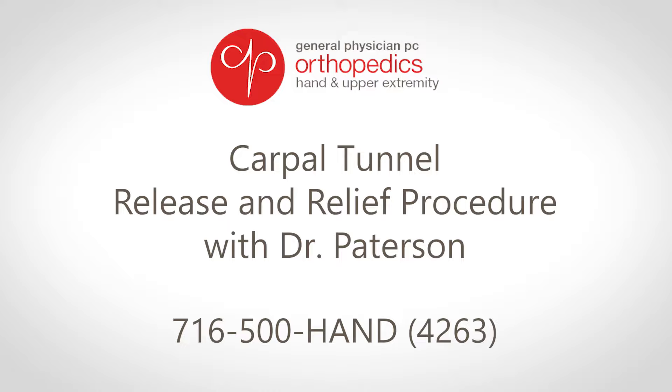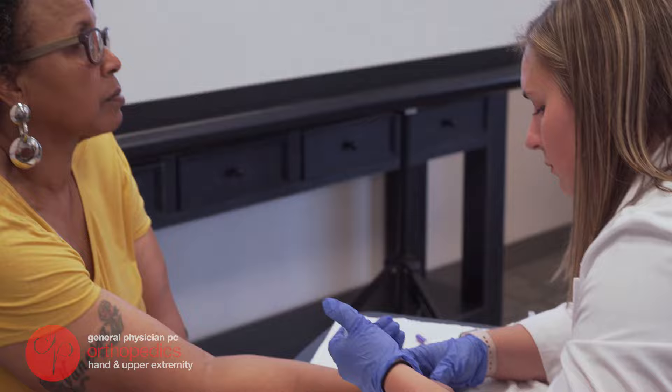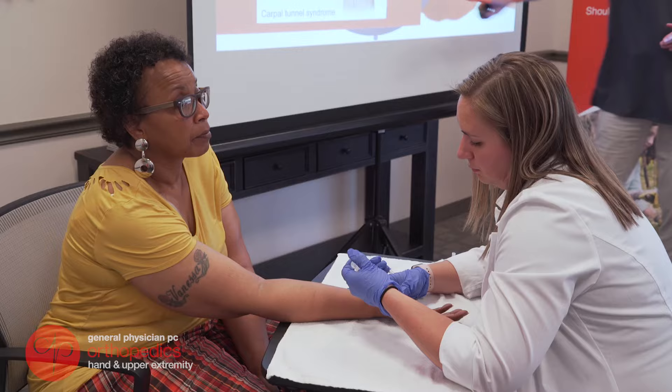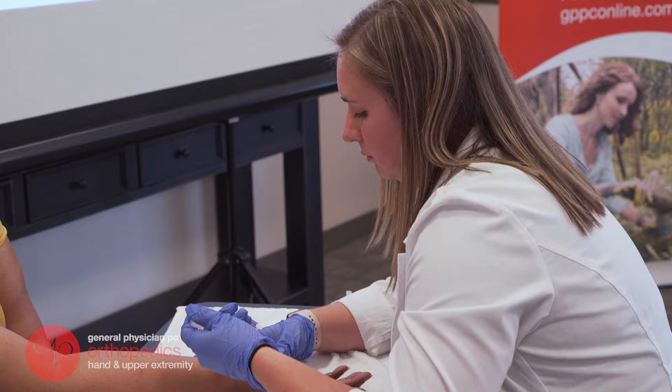Here you can see one of our physician assistants injecting local anesthetic into the wrist and hand. The anesthetic has been buffered and it's injected very slowly to ensure that the only thing that the patient will feel is the first time that the needle enters the skin. After that, they really shouldn't feel anything at all.